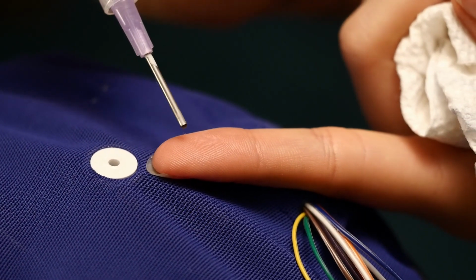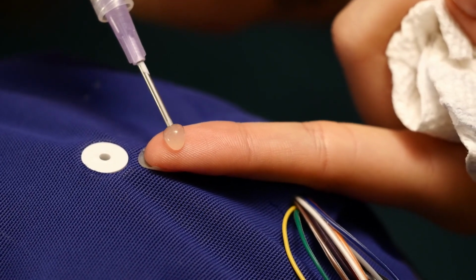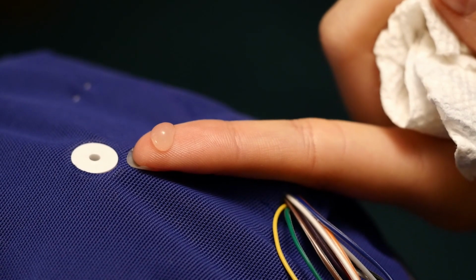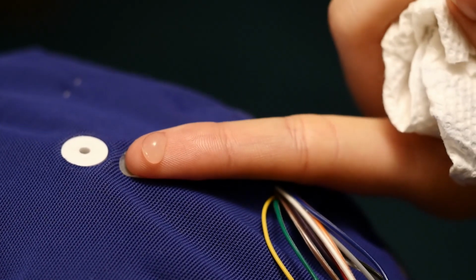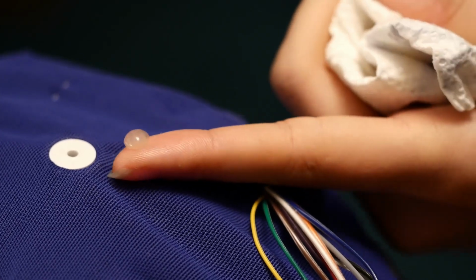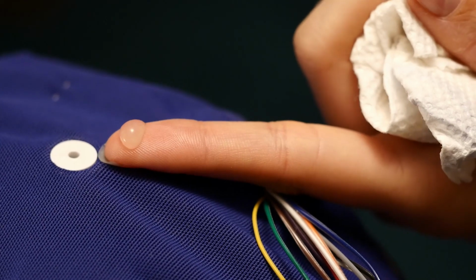My finger is there, and I'm only going to put about a pea's worth on here. It's a little dollop, not much more. You don't want too much gel because it makes both a mess and increases your likelihood for a salt bridge, which we do not want. Salt bridges are risky when you have someone with no hair or thin hair, so avoid at all costs.